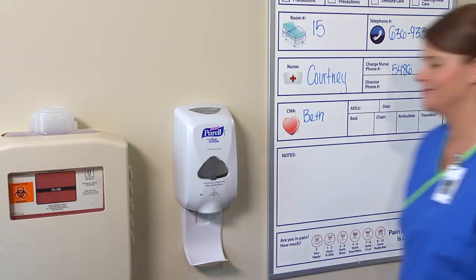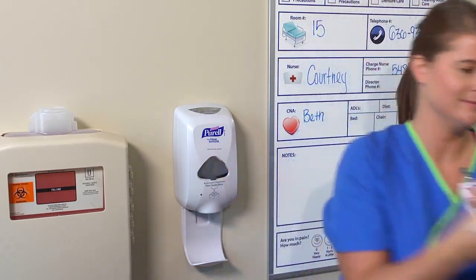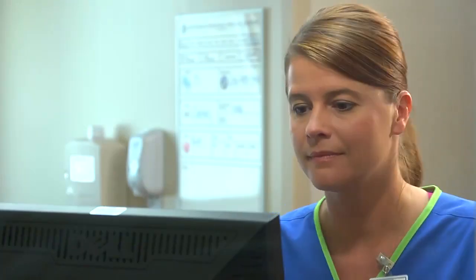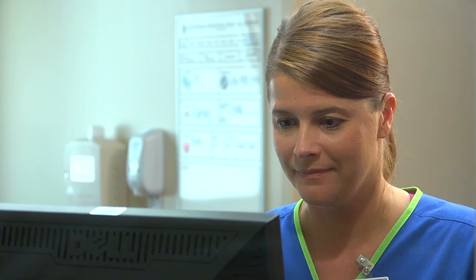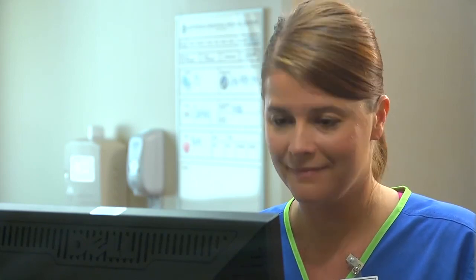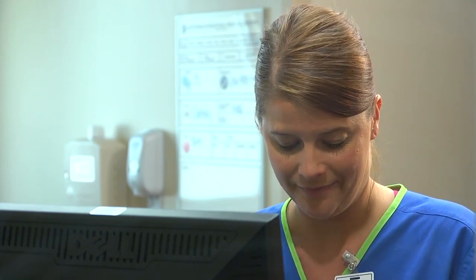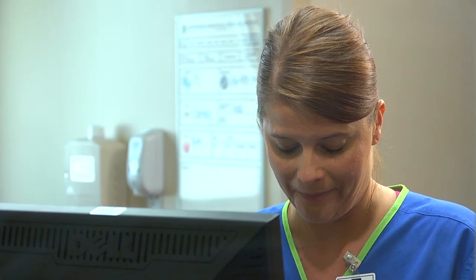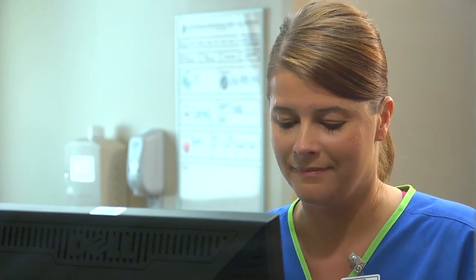Perform hand hygiene. As part of your follow-up care, monitor the patient's vital signs. Note her response to the transfer, and ask if she had any pain during the move from the bed to the stretcher. Record the procedure, including any pertinent observations, such as signs of weakness and the patient's ability to follow directions and assist. Inform the next shift or other caregivers of any assistance that might be needed.